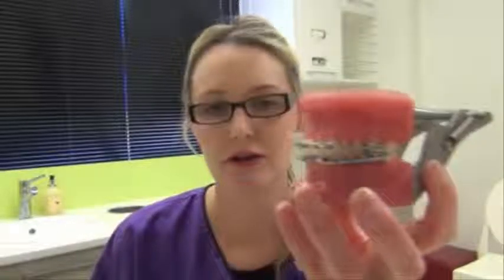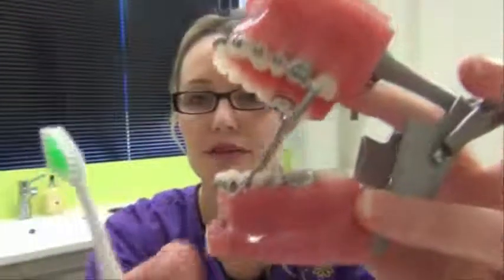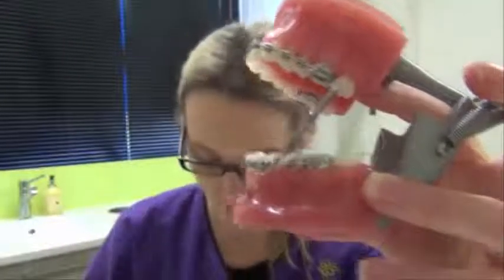It becomes increasingly difficult to clean with the forces springs attached, so use your toothbrush to clean around and gently brush around any of the coils. You may also use the interdental brushes to clean beneath these as well.